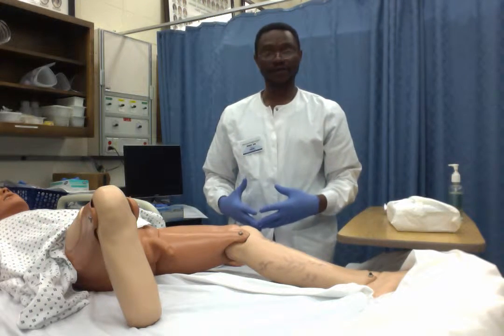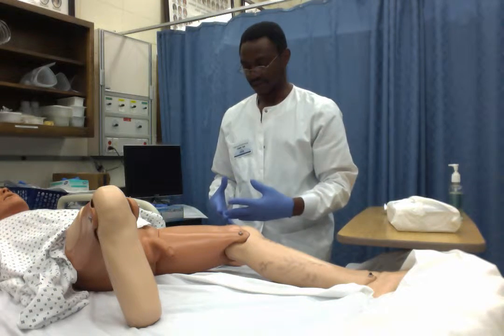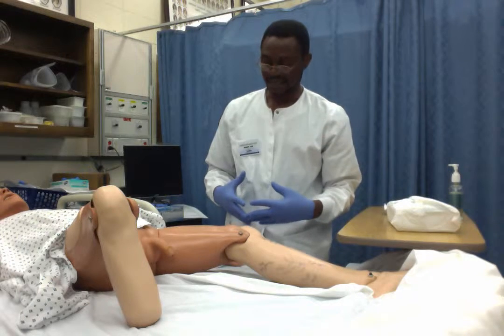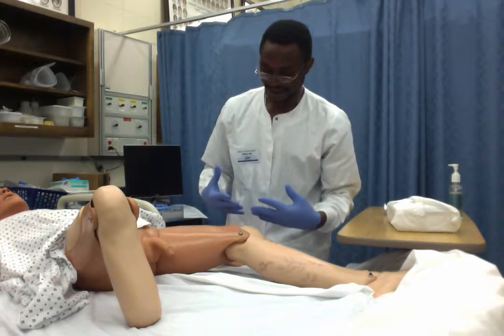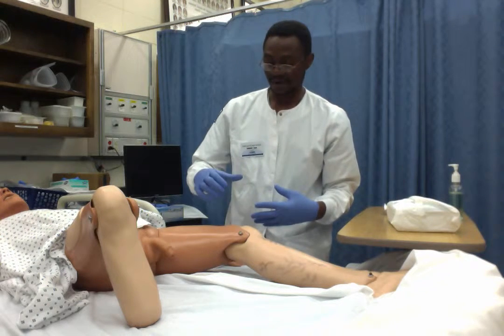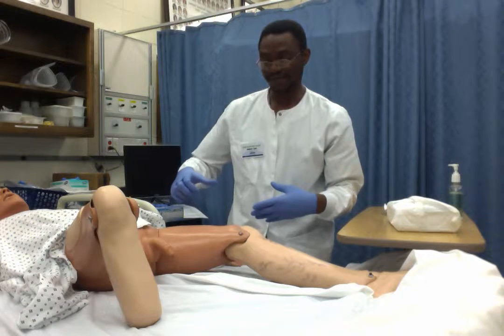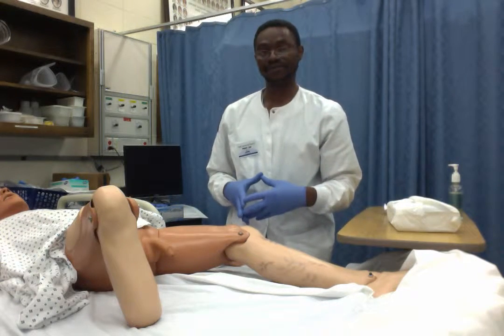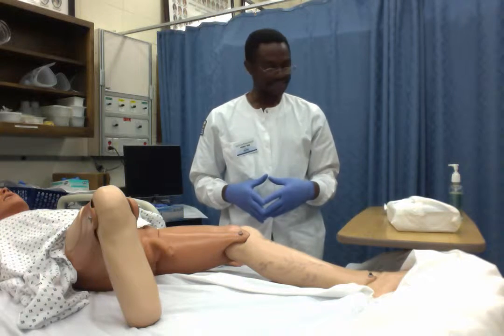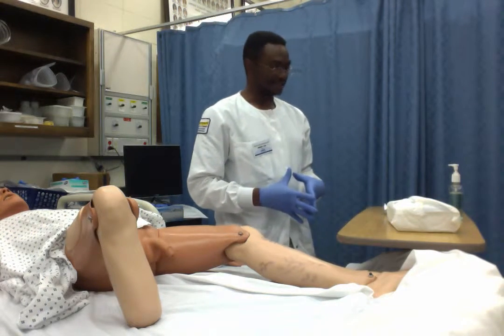Before I carry on with the Foley catheter insertion, I would want to do perineal care on the patient. I will also make sure that if the patient has foreskin on his penis, I will pull it back, clean the area, and make sure I replace it at the end of the procedure. That done, I will now proceed to set up my sterile field.